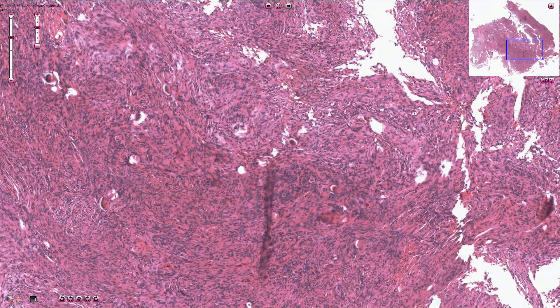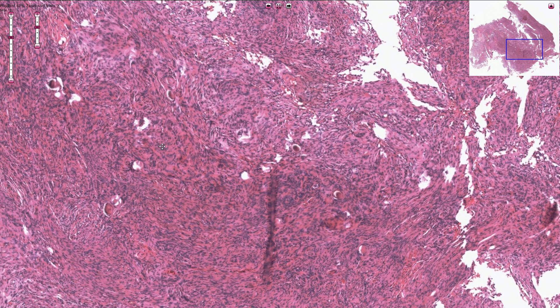Here we have the histology of the brain tumor, which is composed of uniform spindle-shaped elongated cells arranged in a fascicular pattern. We typically see multiple small concentric calcifications called psammoma bodies. These psammoma bodies can also be seen on an x-ray.